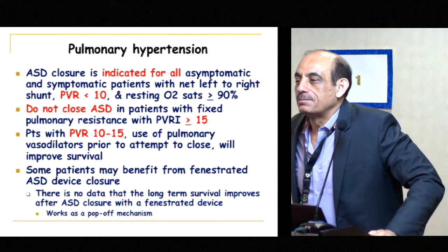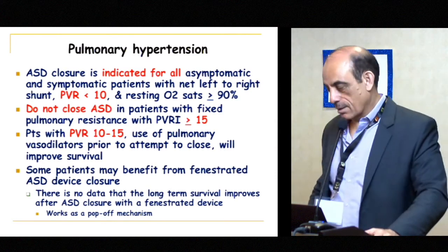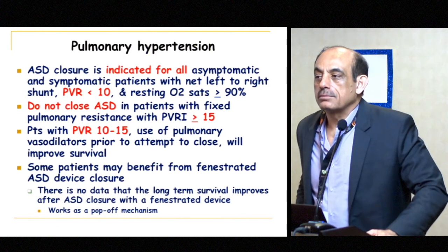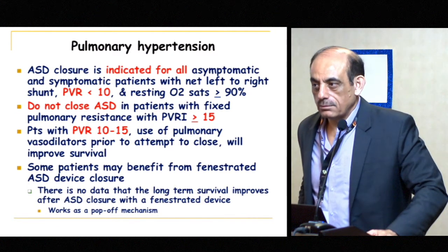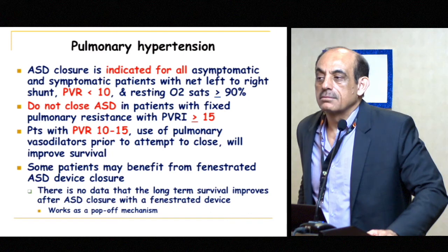Before the cribriform, Matt and I were just talking about this. Before the cribriform, I spent 2 years trying to convince Kurt to make such a device, and he always would say it would be like leaking Cardio-Seals, because it's a non-self-centering device. So we didn't do septostomy, but we did static balloon through one of the fenestrations and decided to do the next one, because we knew we had a device big enough so we could close it.